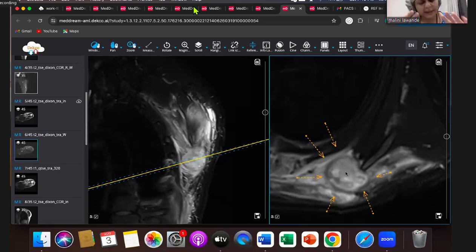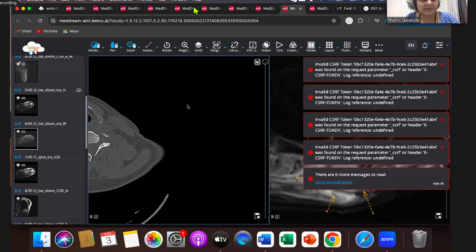Okay. So very typically, this is where we all, like when I started reporting MRIs, I very clearly remember I saw a scan like this in a child. And my first thought was, oh, this is soft tissue sarcoma. And then I did dynamic contrast and tried to plot graphs and all that. And then my professor came and he looked at it and he said, what are you thinking? I said, soft tissue sarcoma. And he said, do you have the X-ray of the child? They had not done X-ray, they had directly done MR. And X-ray or CT will just, all of you will tell me the diagnosis immediately.